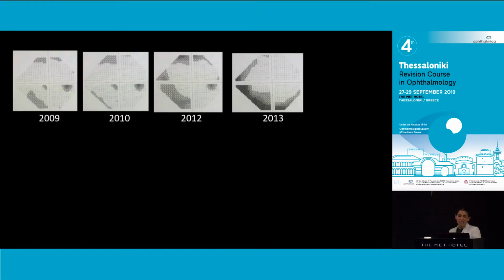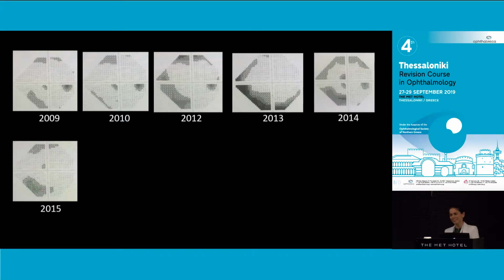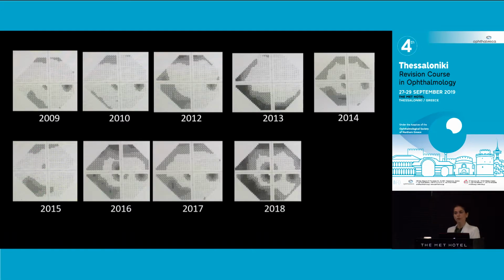Yeah, they were very worried at the time about the visual field and the disc looking very suspicious, so they gave treatment. And with the treatment, this is what happened. Is this patient getting worse? Yeah, probably. 77, 75. So that's what everybody thought: she's getting worse. And then she wasn't getting worse. That's very strange, because this looks a lot better than this. This looks even better than this. But then she got worse again.